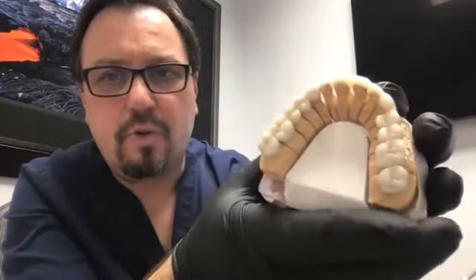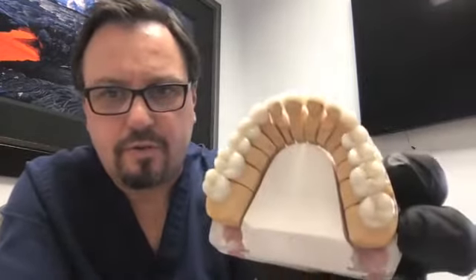The front are feldspathic porcelain. The posteriors, which I can show this way easily, are zirconia. So typically what we do is we layer the buccal cusps in feldspathic, kind of layered zirconia porcelain, and then the occlusal and palatal and interproximal is full contour zirconia, and the second molars are pretty much full contour zirconia.